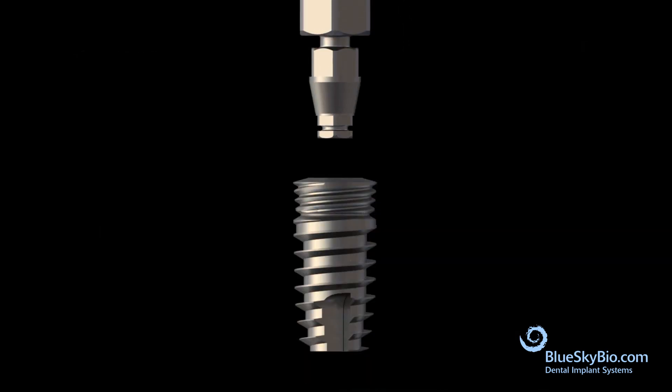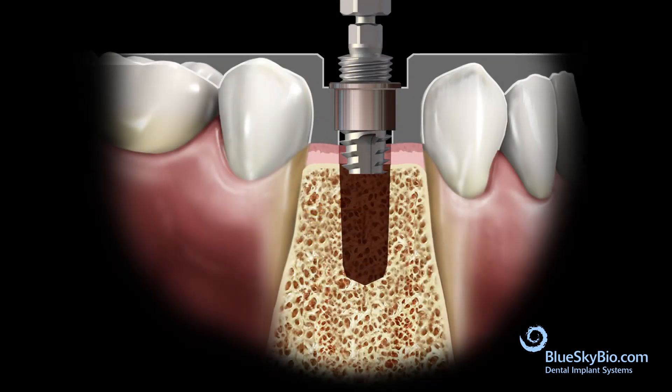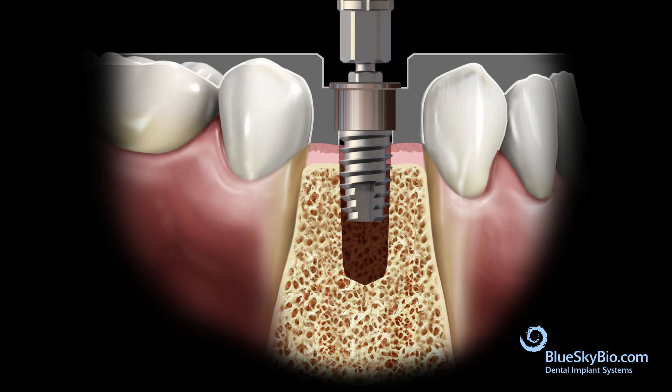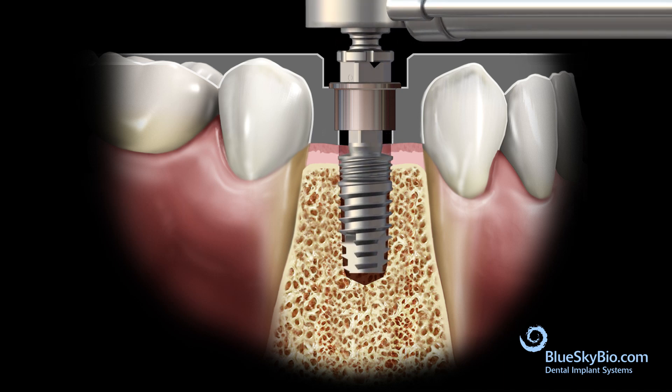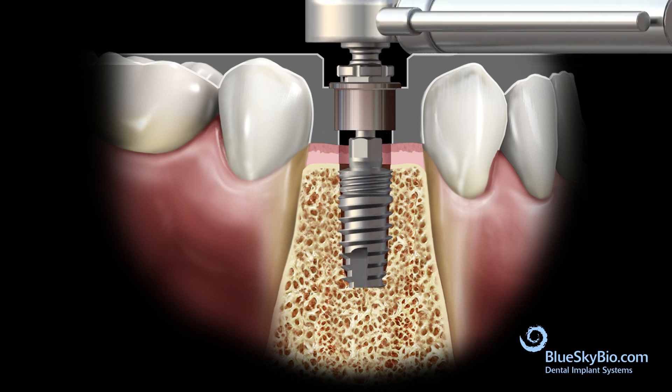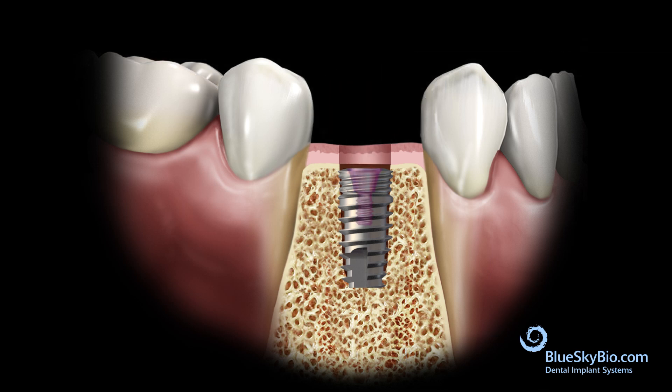Place the 8.5 millimeter fully guided carrier into the implant. Insert the implant and driver through the guide using the ratchet until the stop on the guided carrier bottoms out. It is very important to stop ratcheting the implant the moment the stop touches the guide tube, in order to avoid stripping the bone and losing primary stability.